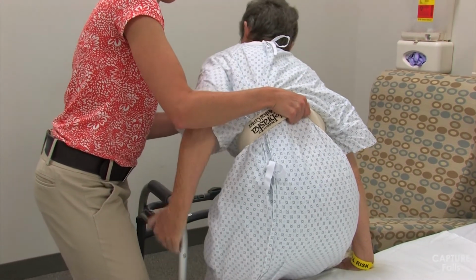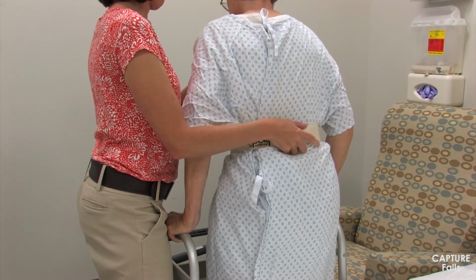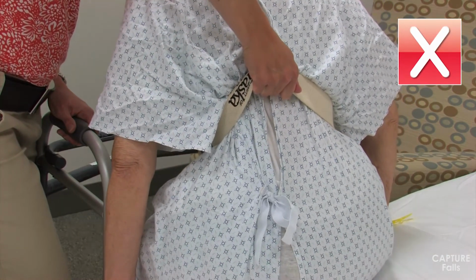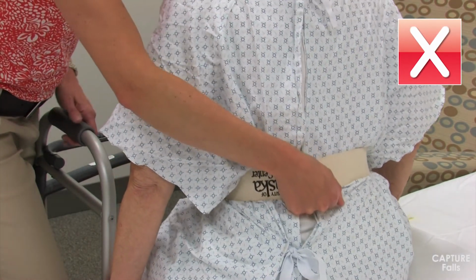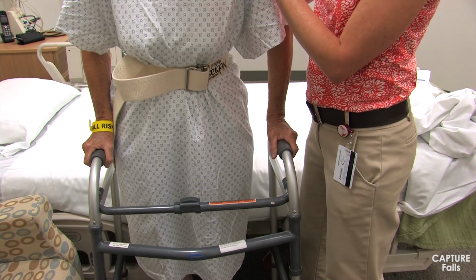Position yourself along the side of the patient opposite the chair so that you will not be in the way as the patient turns. You should hold onto the gait belt with the palm of your hand facing up. Instruct the patient to lean her trunk slightly forward and to push through her arms and feet to stand. Don't simply pull straight up. This is uncomfortable for the patient and increases your risk for back injury. Rather, you can use the hand that is on the gait belt to assist her in shifting her weight forward over her feet. Once the patient is standing, make sure that both of her hands are on the walker.